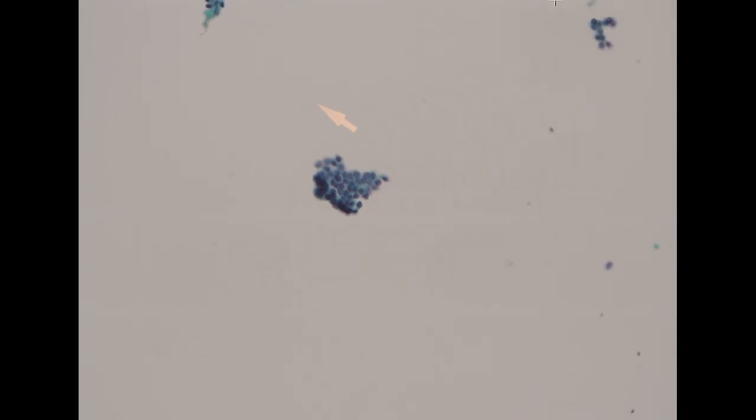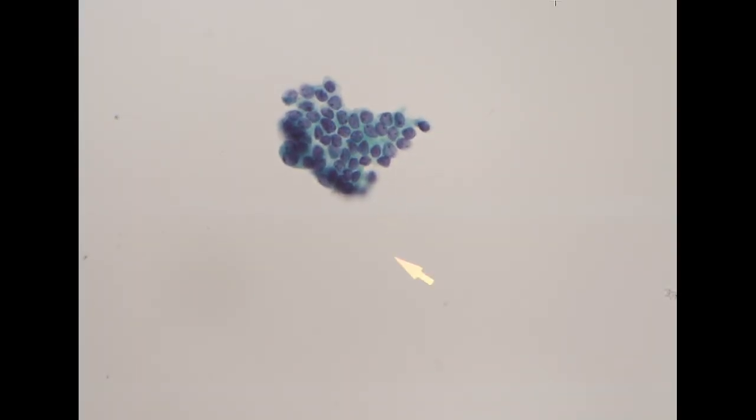So whenever we have this impression, we need to go to higher power to check if there is any cytologic atypia. So when you go to the higher power, you can tell that the nuclear feature does not look like a follicular neoplasm because it shows markedly elongation, and if you check with the long axis, it all close with each other. And you also see some grooves somewhere, and here it's sort of forming a decapitated papilla, right? So it looks like a PTC.